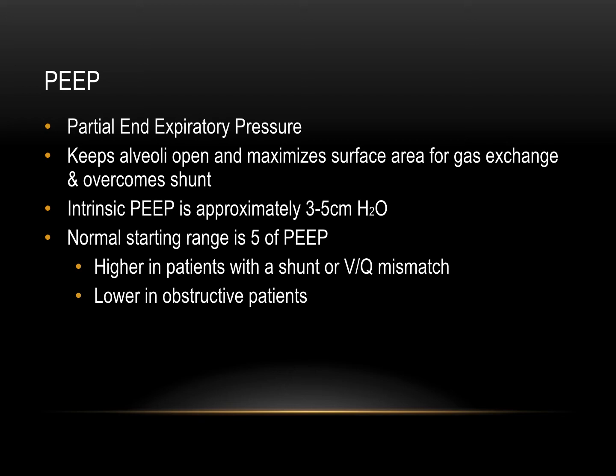This balloon is tight. It's perfect. There's not really much air in there. It's just water. And imagine that as an alveoli filled with fluid from congestive heart failure. So when we add PEEP, what we're doing is we're adding air to that balloon. And now we've got the same amount of fluid in there, but we've got much more air.